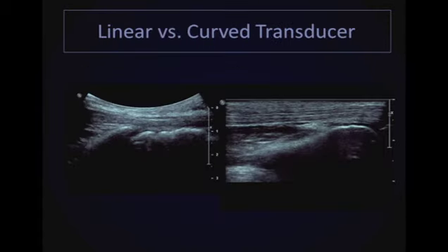First off, for musculoskeletal ultrasound, we prefer to use a linear transducer, and that is because normal tendons have a linear structure. A normal tendon is hyperechoic and composed of fine parallel echogenic fibrils, which make up the collagen fibrils. And with a linear transducer, you can see that these fibrils come into view quite nicely as the sound is bounced off them when they are at a 90-degree angle to the transducer.